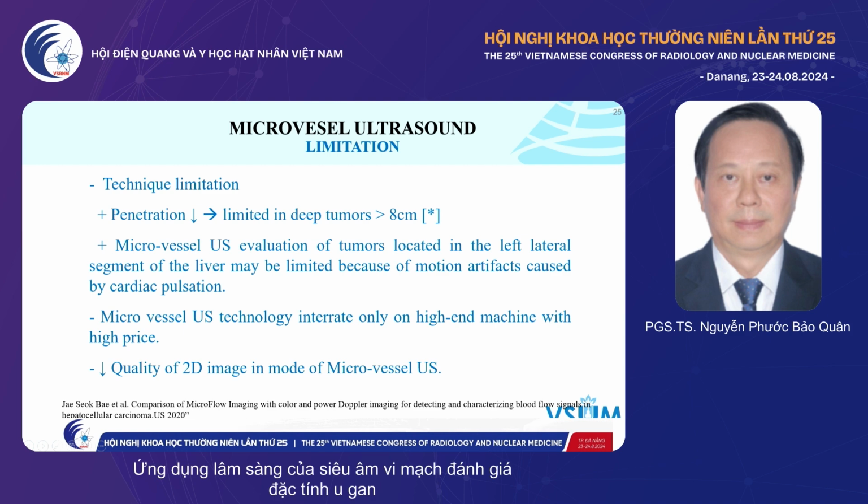We talk about the limitations of the technique of microvascular ultrasound. This is a Doppler-based technique, so it has a limitation in penetration. It is difficult to investigate tumors located deeper than 8 centimeters, and particularly tumors located in the left lobe, because it is difficult to investigate the vascularization of the tumor due to cardiac pulsation.